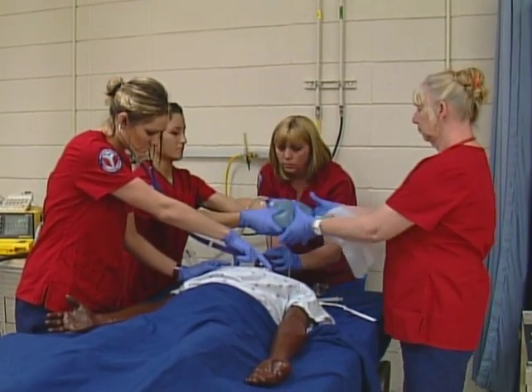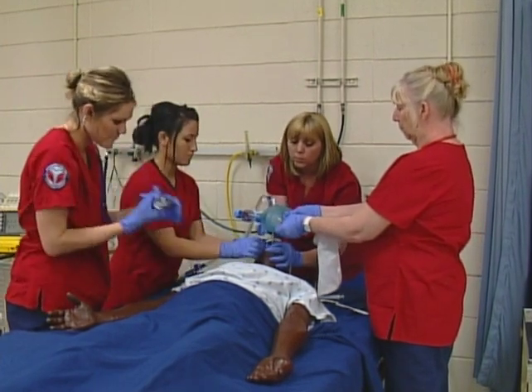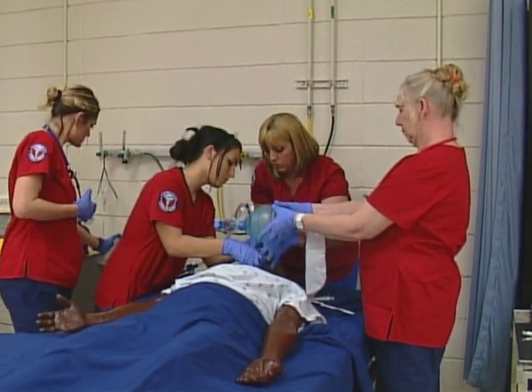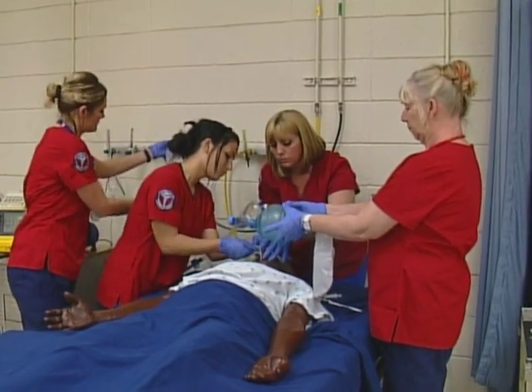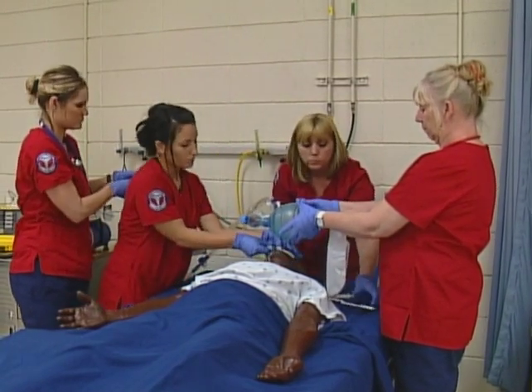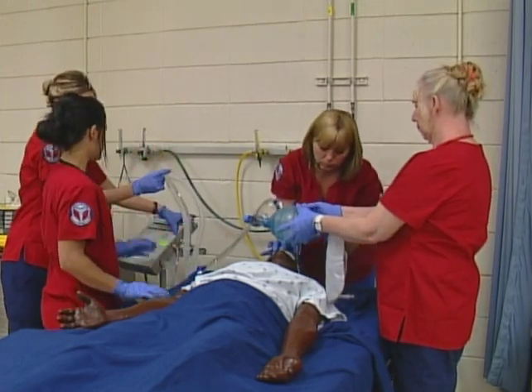You'll see Bobby now, she's auscultating the chest, breath sounds, making sure that we're getting air in both of those lung fields. That makes us know that we've got that ET tube in the right location. Affixing the ET tube holder to the patient. This ensures that the holder stays in place during the variety of procedures this patient may be subjected to during their stay.